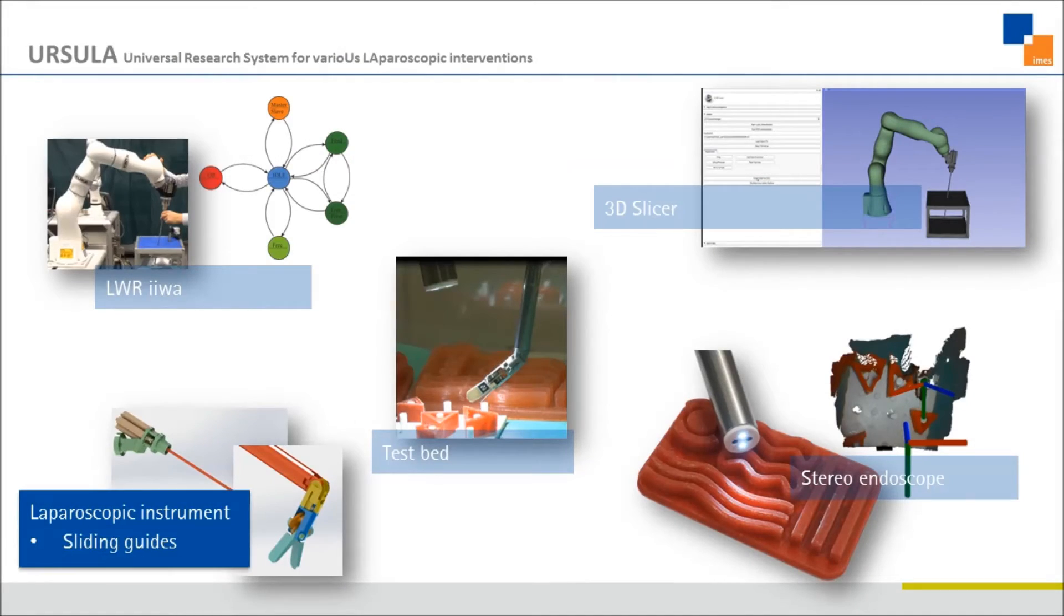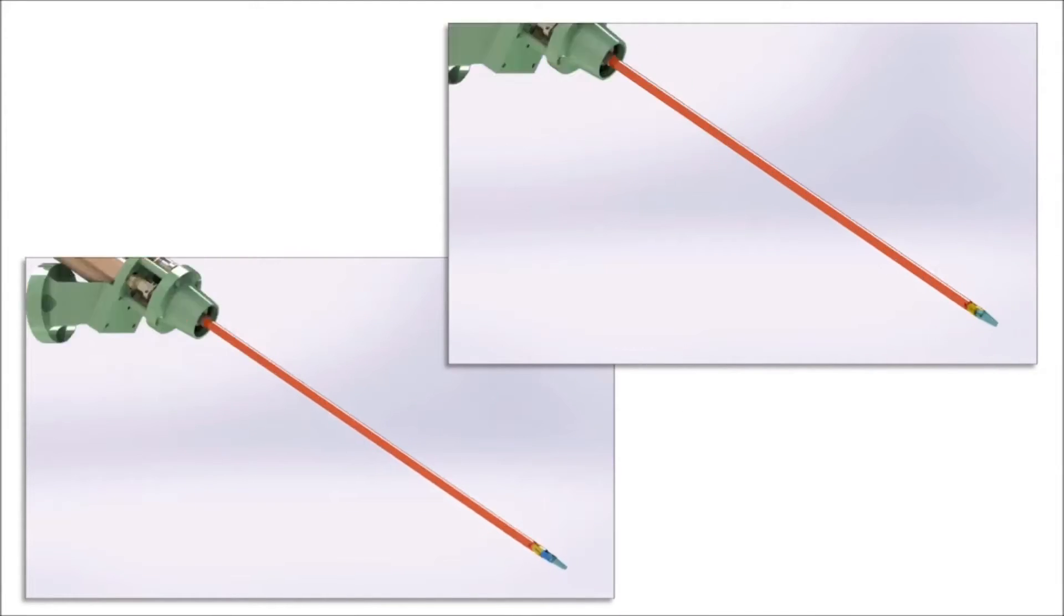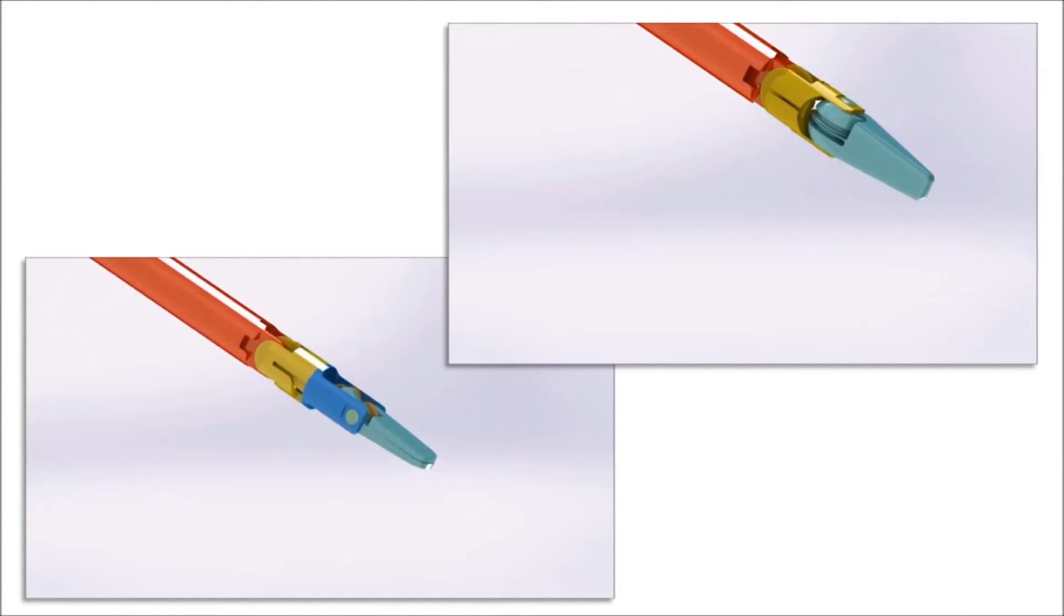Our two custom-made instruments include sliding guides for the actuation ropes. Each instrument consists of three major components: actuation unit, shaft, and distal assembly.